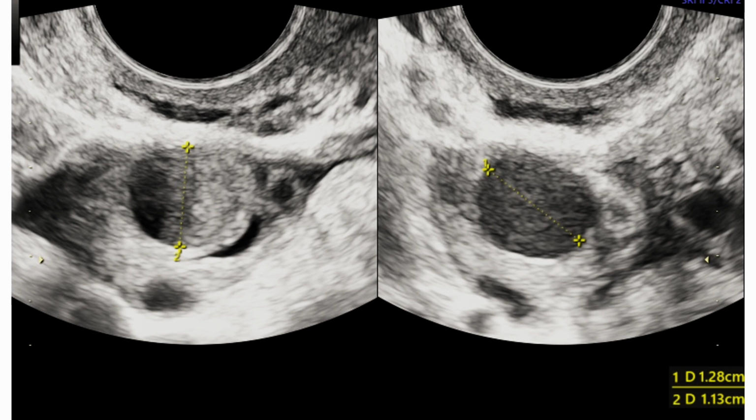Following the protocol, I went ahead and looked at the ovaries, and I saw this small cyst. It was only 13 mm in size, but it did show this layering of echoes. So here is the hyperechoic layer, a slightly less hyperechoic layer, and then an anechoic layer in this cyst. And then it made me think that maybe we are dealing with a case of endometriosis.